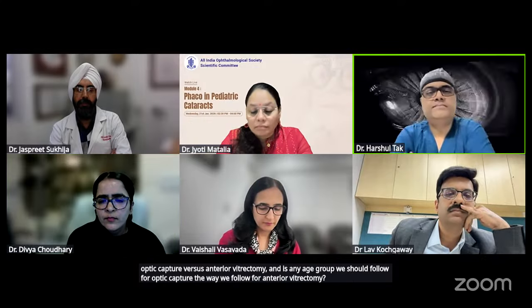I would like to ask the experts, what is your experience with optic capture versus anterior vitrectomy? And is there any age group we should follow for optic capture, the way we follow for anterior vitrectomy? I think Savelina had written a very good paper on optic capture versus in the bag, and we found similar results in both of them regarding the PCO rate. The main purpose of doing it is stability and avoiding visual axis obscuration. We didn't find any difference over a 2-year period.